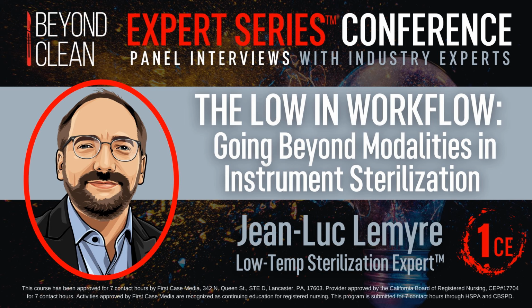And if I can go to my second thing, it is drying. Low temp sterilization requires the device, but also the packaging, to be dry. We don't want liquid water to go into that chamber because that will create some failure of the sterilization process, or it could create failure. So it is very important to dry the device and make sure that even locations that are not visible by the naked eye get dry.